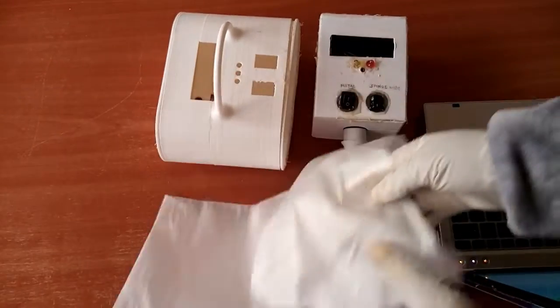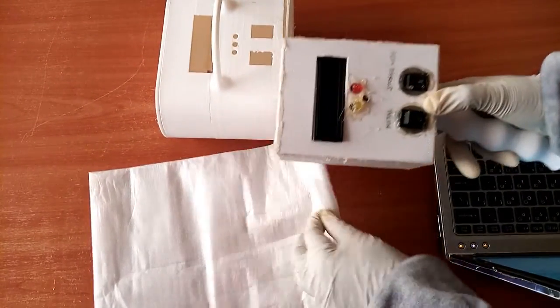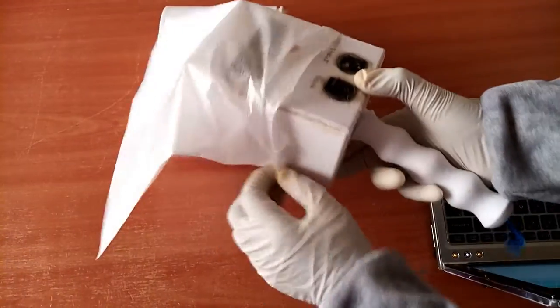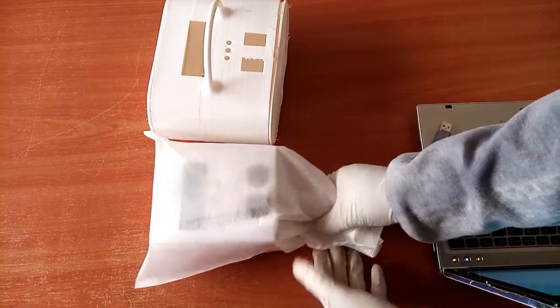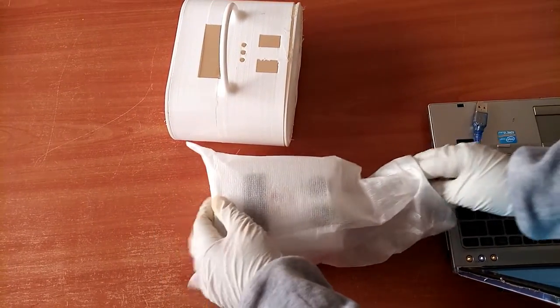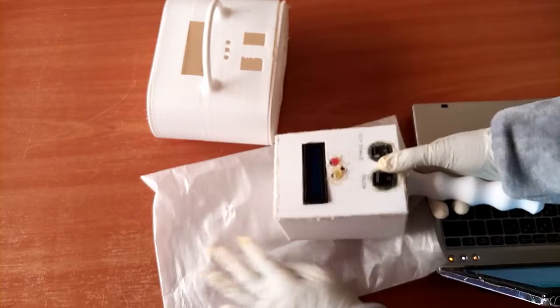So I'll take our device and demonstrate how it will work. So you take your device, you put the sterile disposable cover. This means that the sterile disposable covers have to be bought every time, now and then. So you put your device inside the cover. Then the doctor will be able to scan the patient. And then after scanning, the sterile disposable cover will be removed, after which it will be disposed. The sterile disposable covers can only be used once.